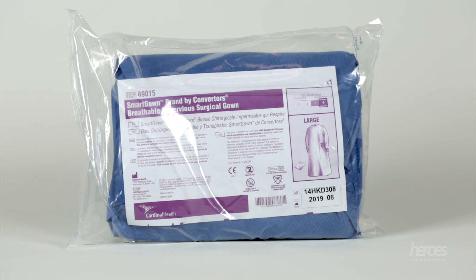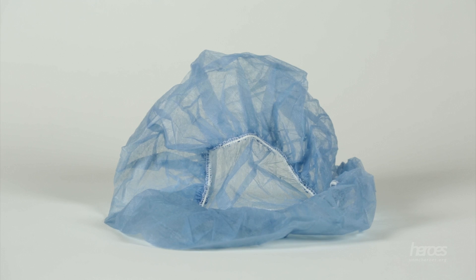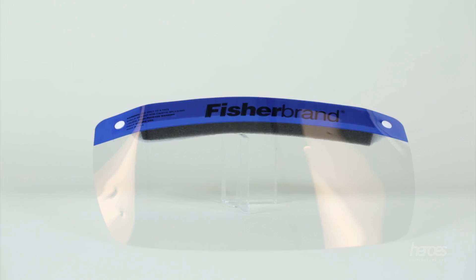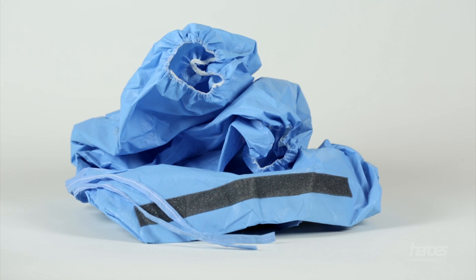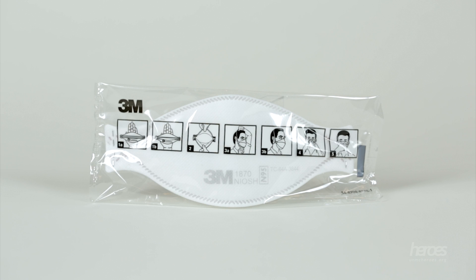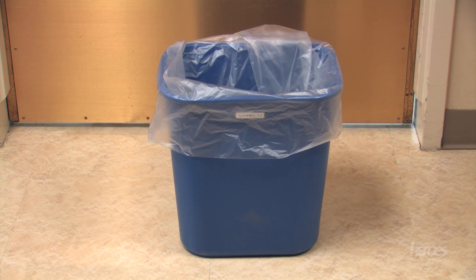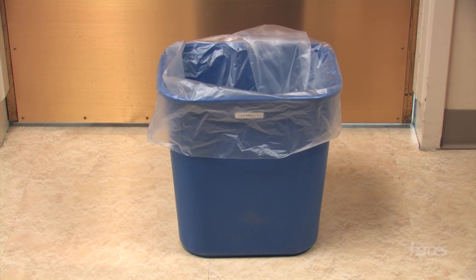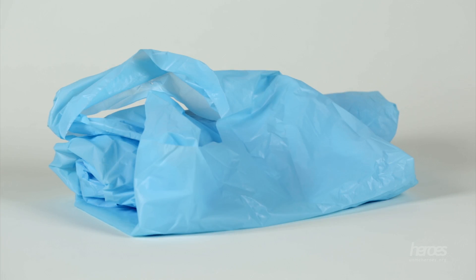You will need the following equipment: a surgical gown, a surgical cap or hair cover, a standard hair cover, a face shield, standard patient gloves, surgical boot covers, an N95 respirator — either the blue style or the tri-fold style — a pair of long cuff purple nitrile gloves, a trash receptacle, an autoclave bag or a biohazard bag, a roll of duct tape, and a splash protection apron.